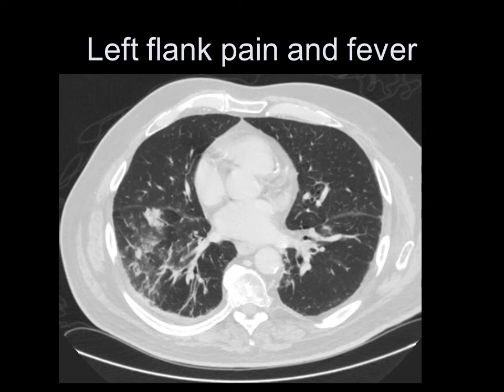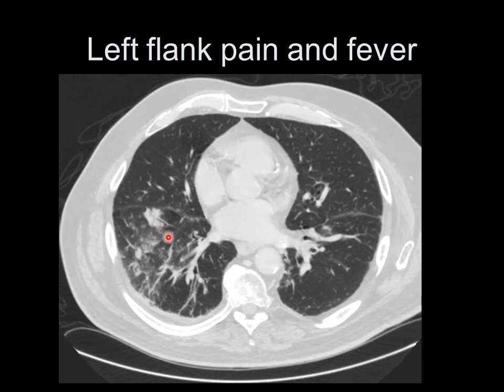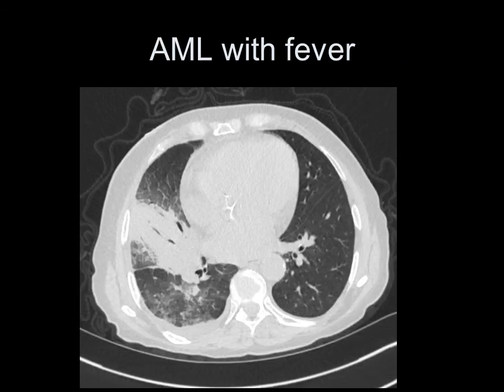This patient had left flank pain and fever. We can see some irregular areas of opacification in the right lower lobe. The most prominent one has rather irregular margins and doesn't look like it's losing any volume. There are a couple of other areas with irregular margins next to it, so this I would call an area of consolidation.